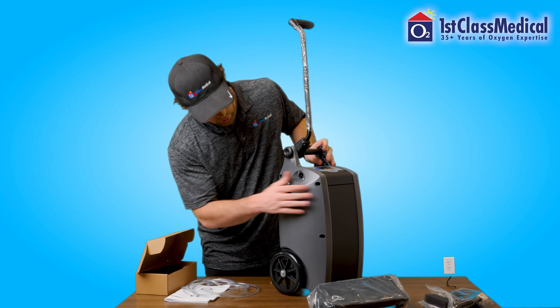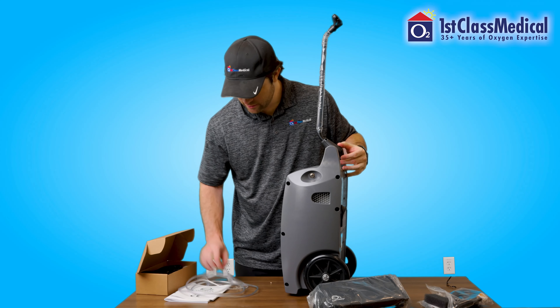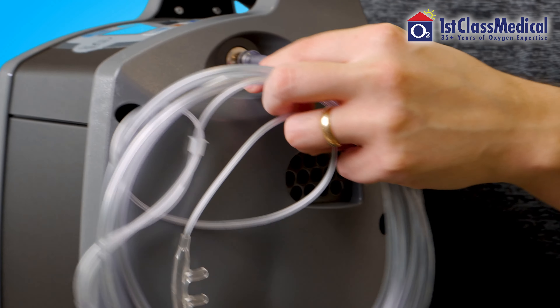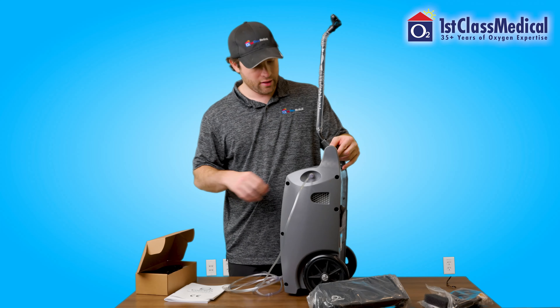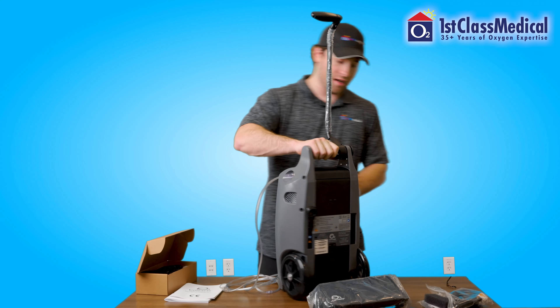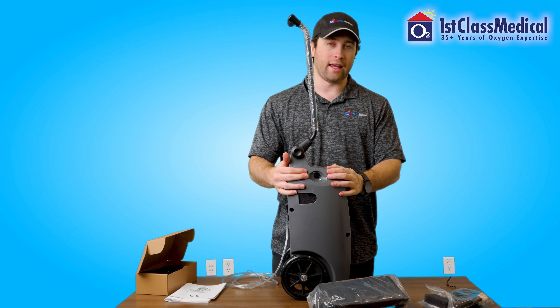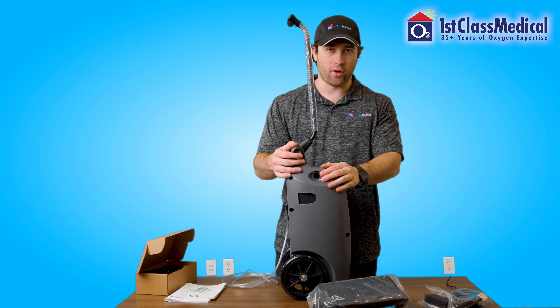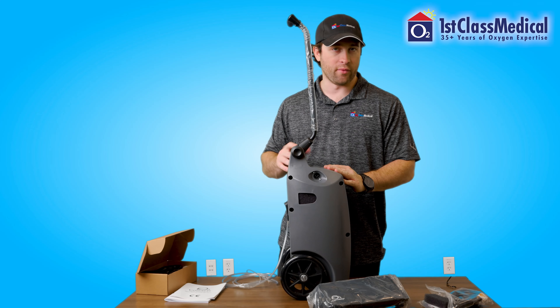You have your cannula port on the side of the unit. You have your cannula, also known as the oxygen tubing, go into this port — the other end, of course, going into your nose. You'll also have access on the opposite side for the AC and DC power supply that comes with the unit. When plugged into the wall, you'll be able to use this unit and charge your battery at the same time while in use.